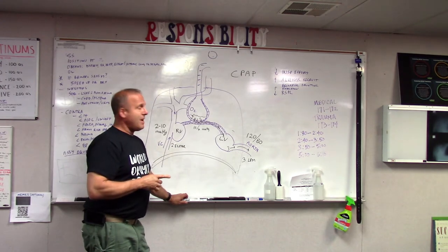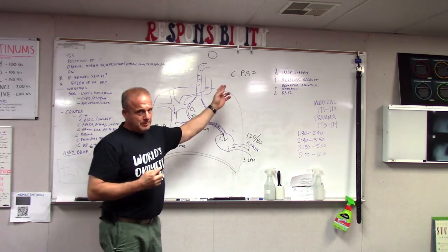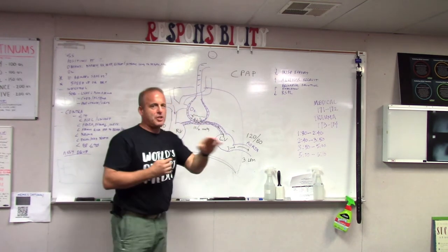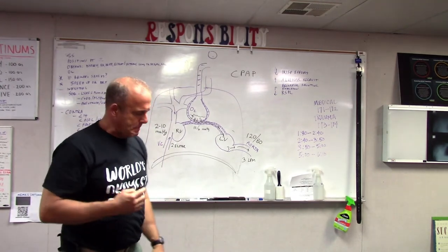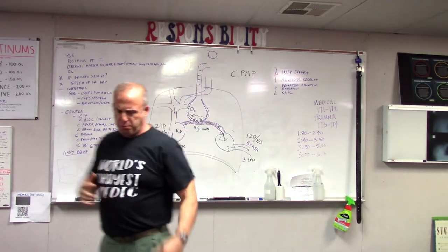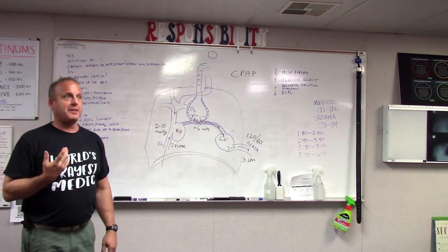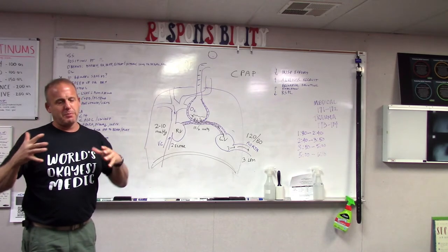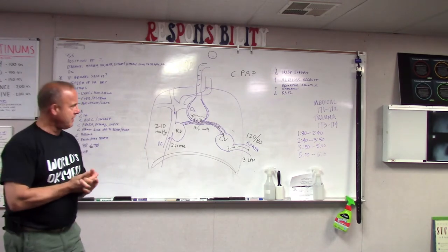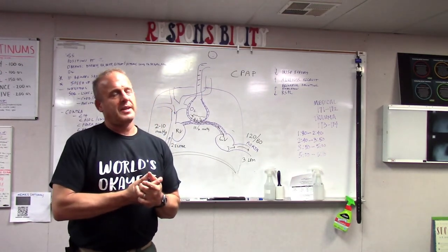Misconception number one, and probably two and three because it's such a misconception, is that by applying CPAP, you push, as if pushing air down here will somehow push the fluid out of the alveoli. Well, again, think of that toilet thing. Imagine you were just pushing air on the water and hoping that'll somehow unclog the toilet. Hypothetically, it's possible if you had a massive mega plunger, and you put it on the toilet seat and sealed off the leaks around the rim, you might do that. Pretty hard, pretty inefficient.